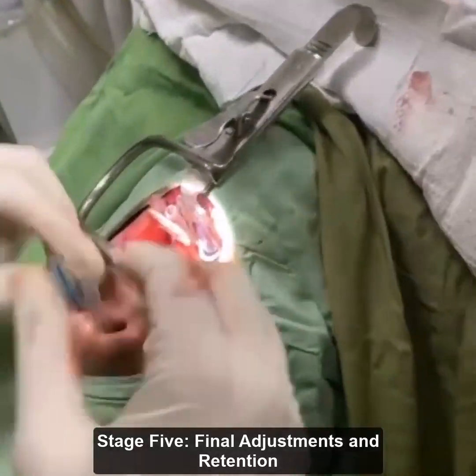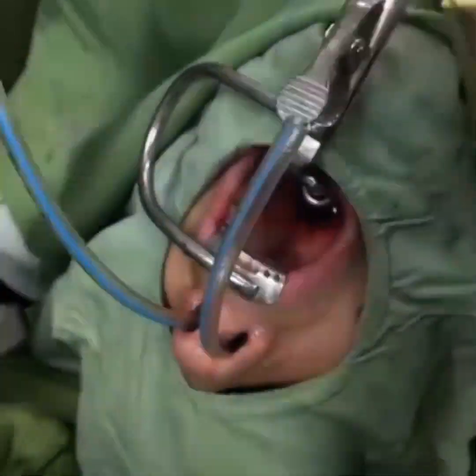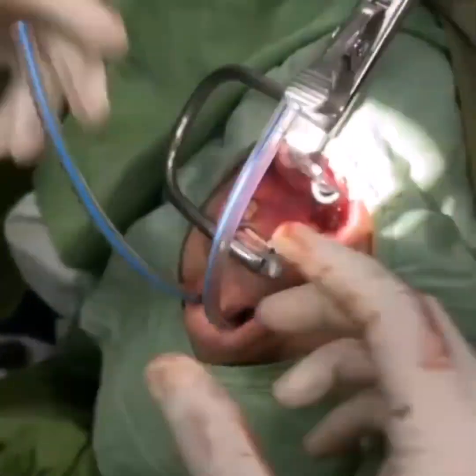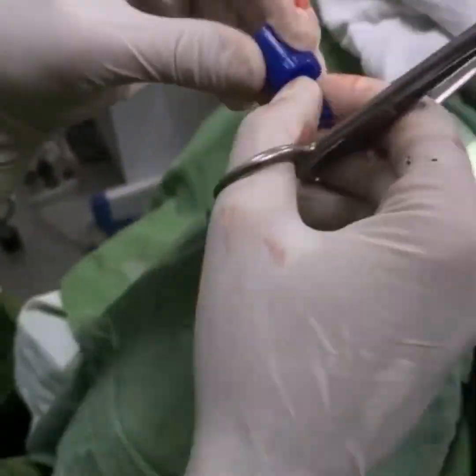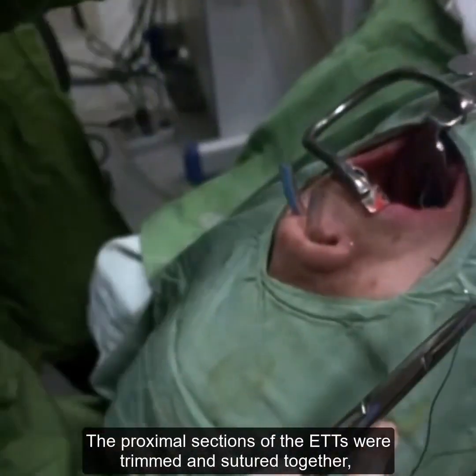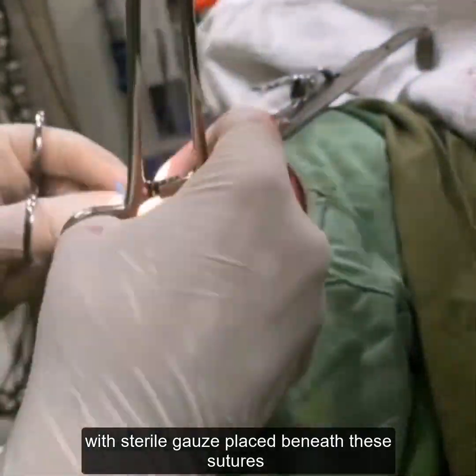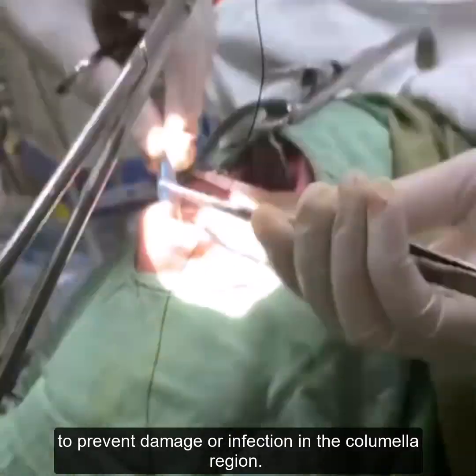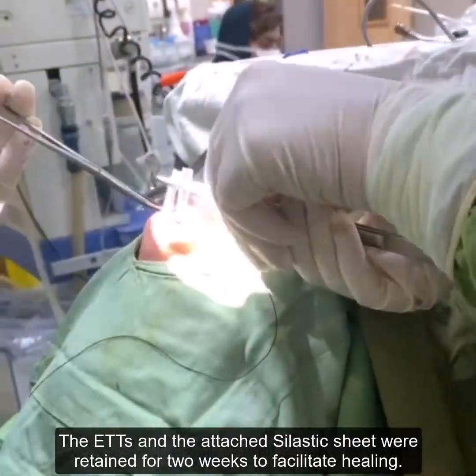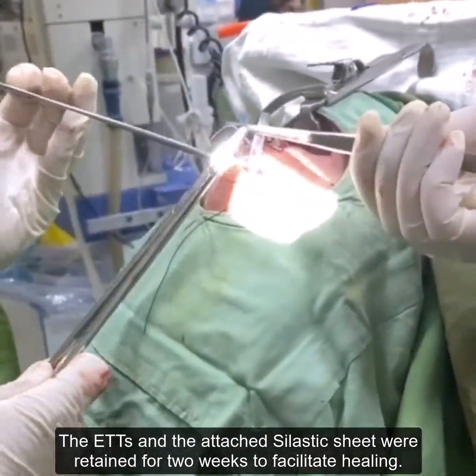Stage 5, final adjustments and retention. The proximal sections of the ETTs were trimmed and sutured together, with sterile gauze placed beneath these sutures to prevent damage or infection in the columella region. The ETTs and the attached celastic sheet were retained for 2 weeks to facilitate healing.